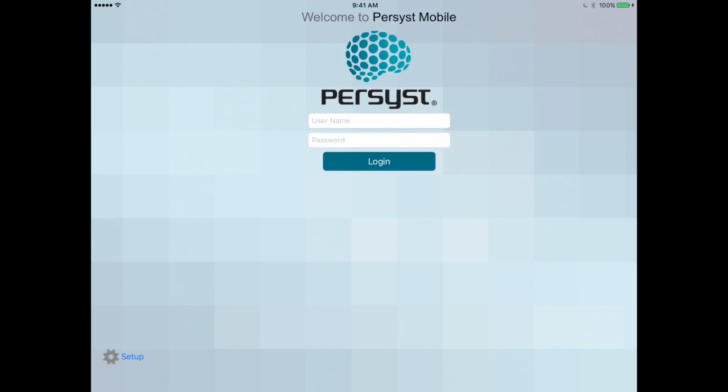Hi, I'm Nico Nierenberg, the CEO of Persyst, and I'm very pleased to present this preview of Persyst Mobile. Persyst Mobile is our new application for iOS.